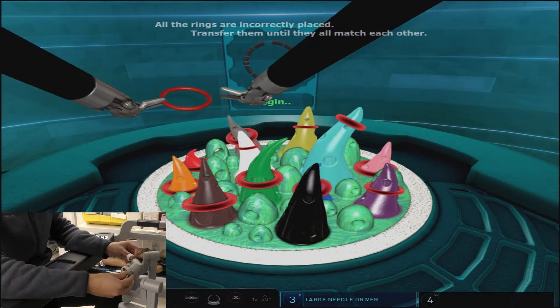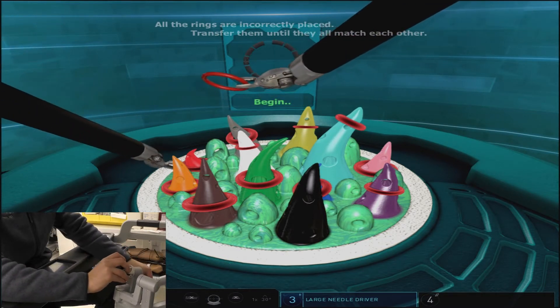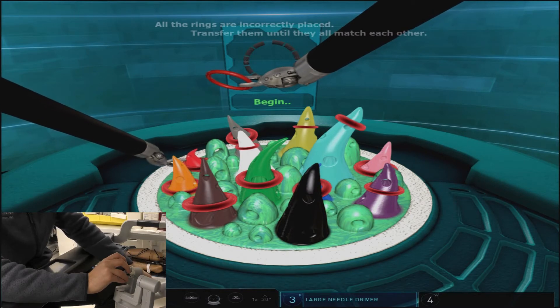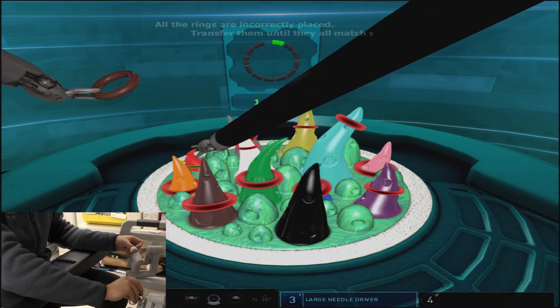You can see here that we started with the black cone and picked up the incorrect ring off that cone, which gave us a red ring, and so now we have to move in the direction of the red cone in order to correctly place that ring.